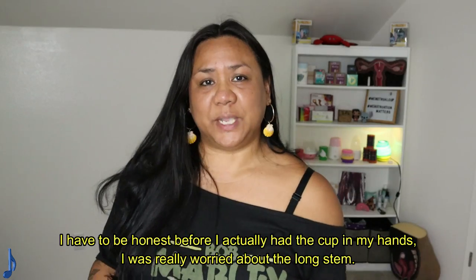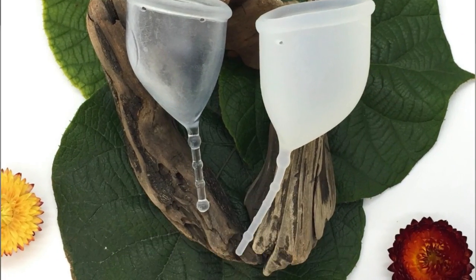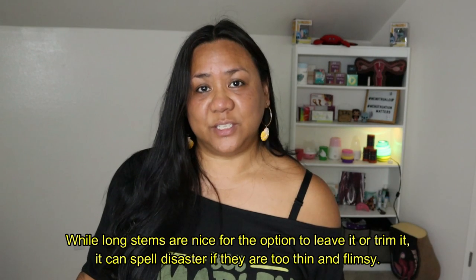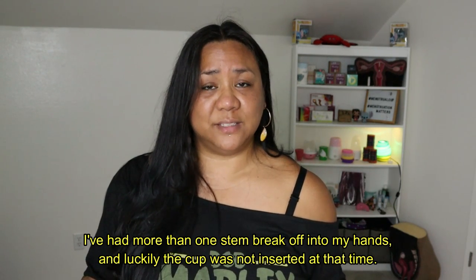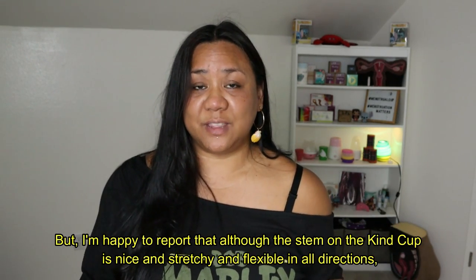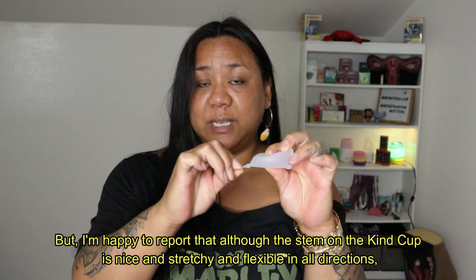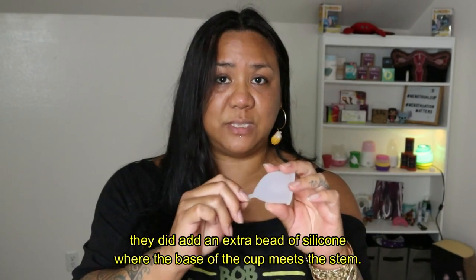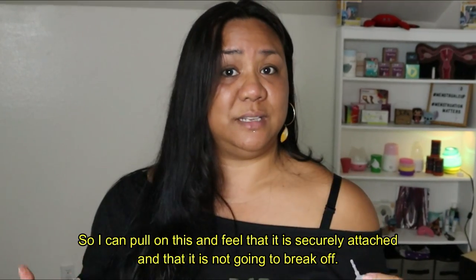Wearing the Kind Cup. I have to be honest — before I actually had the cup in my hands, I was really worried about the long stem. While long stems are nice for the option to leave it or trim it, it can spell disaster if they are too thin and flimsy. I've had more than one stem break off into my hands — luckily the cup was not inserted at that time. But I'm happy to report that although the stem on the Kind Cup is nice and stretchy and flexible in all directions, they did add an extra bead of silicone where the base of the cup meets the stem.